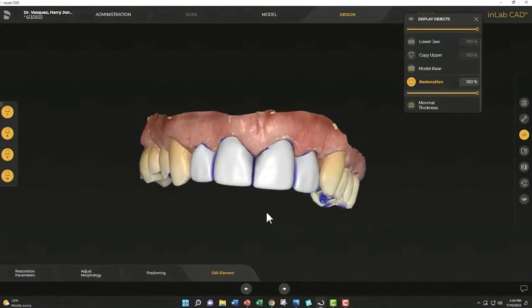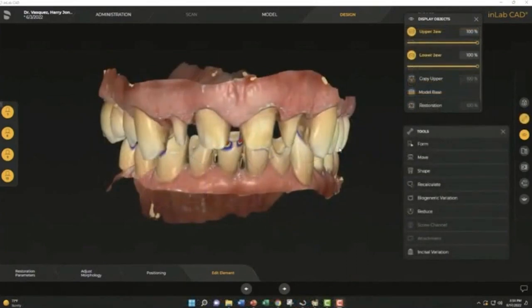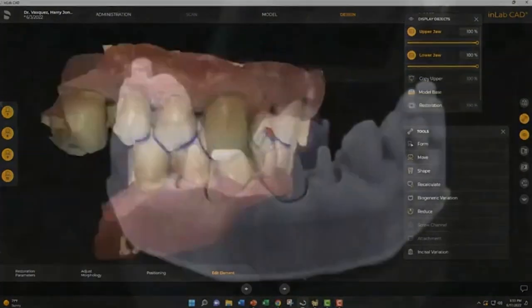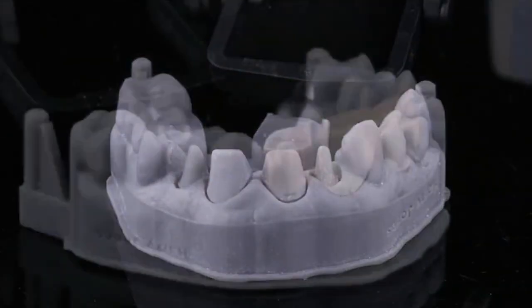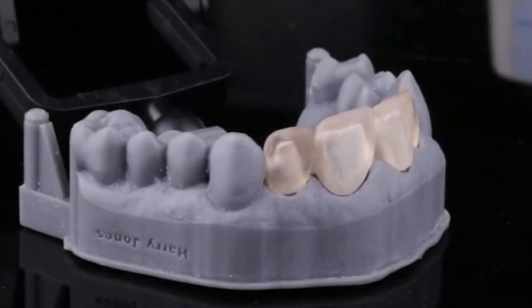We designed it. We printed them. We created a model. And the next thing we did, we delivered to the patient, and here's the printed model with dies, and this is with the final restorations. We delivered these to the patient.